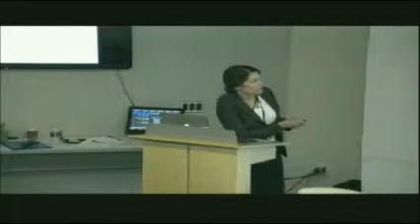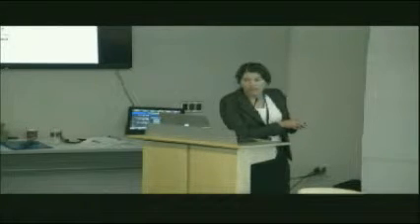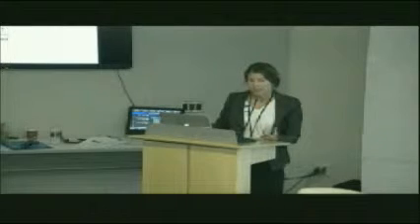There's also something called intracortical excitability. So you give a test pulse. I didn't mention this, and I will. When you use this coil, there are single pulses. So there's just a single pulse for about a millisecond that is provided, and that's what gives you this single MEP wave. So you give a test pulse. Now, it turns out that if you give 2 in a row kind of quickly, that is considered inhibitory. So you can see that the signal is smaller, right? If you give them 2 pulses a little further apart, now it's excitatory. So I can modify what kind of stim I give and get different information.